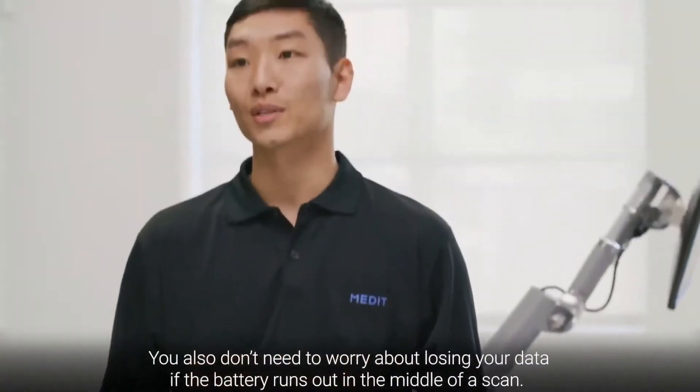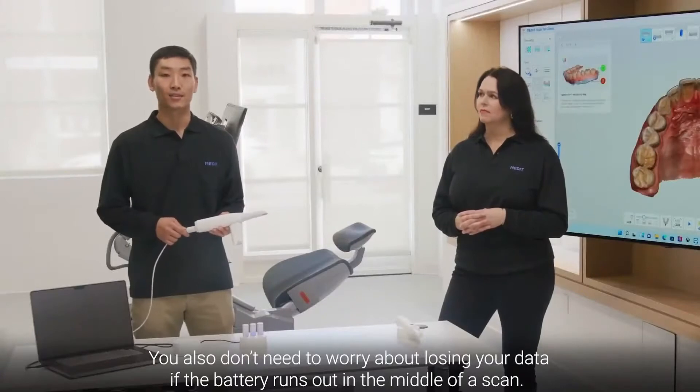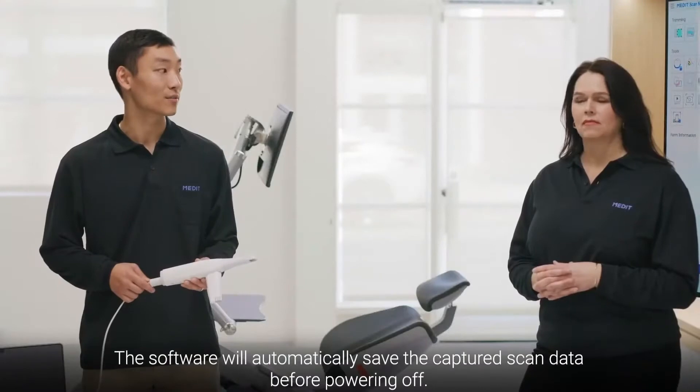You also don't need to worry about losing your data if the battery runs out in the middle of a scan. The software will automatically save the captured scan data before powering off.